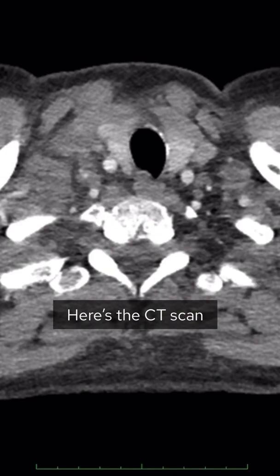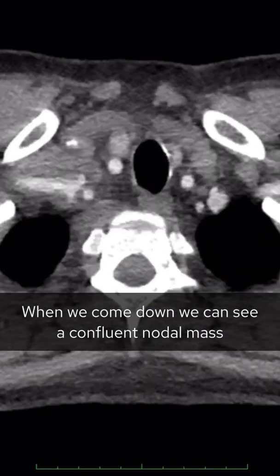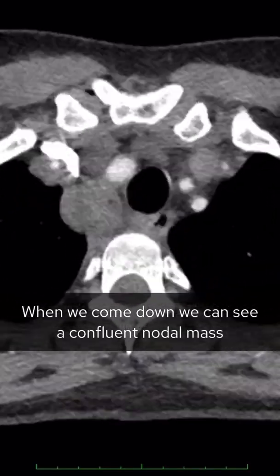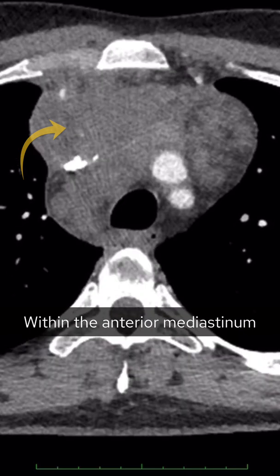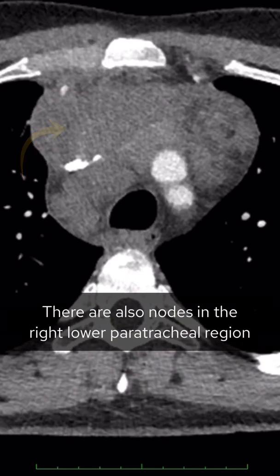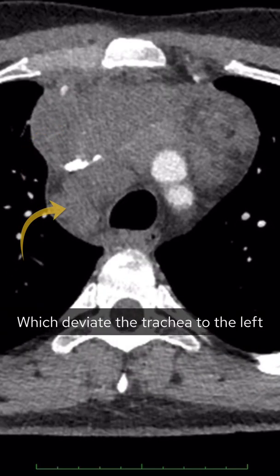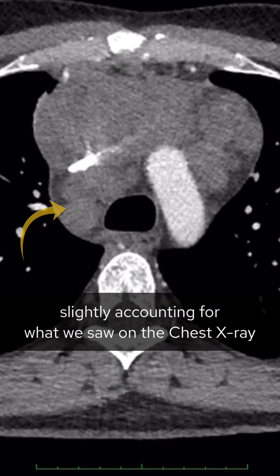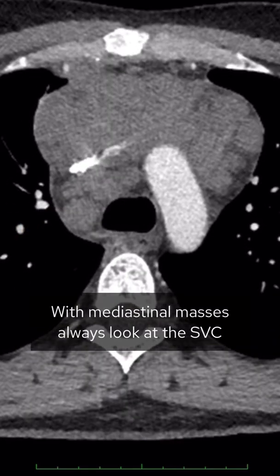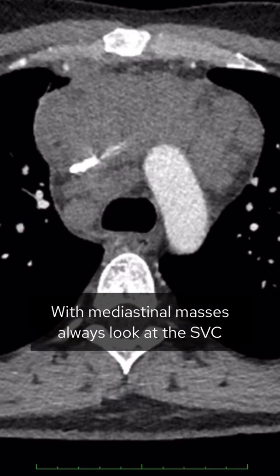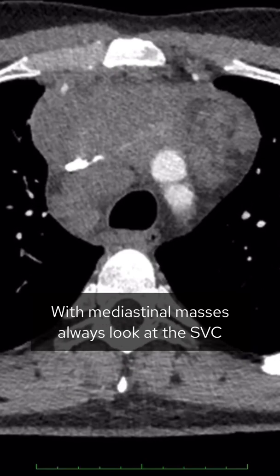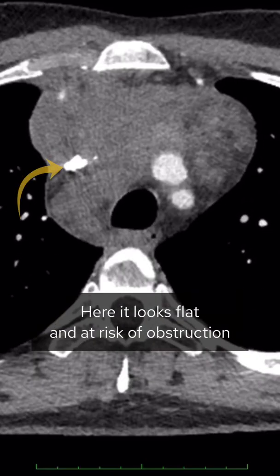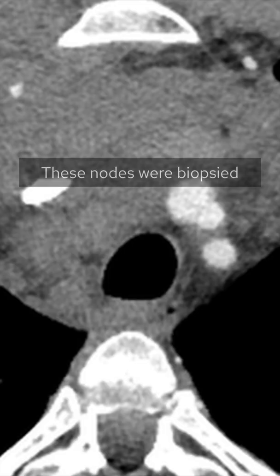Here's the CT scan. Coming down, we can see a confluent nodal mass within the anterior mediastinum. There are also nodes within the right lower paratracheal region which deviate the trachea to the left slightly, accounting for what we saw on the chest x-ray. With mediastinal masses, always look at the SVC — here it looks flat and at risk of obstruction.